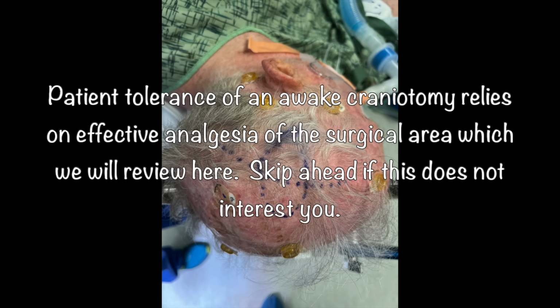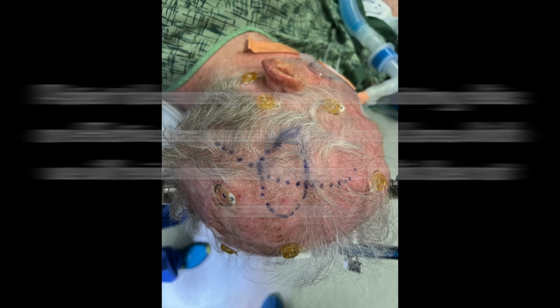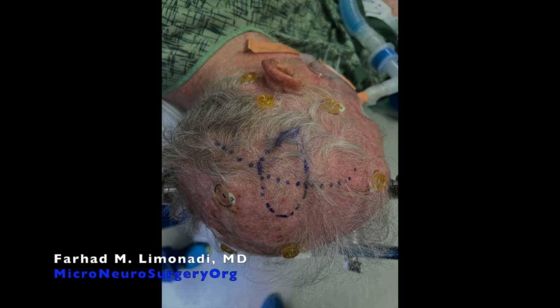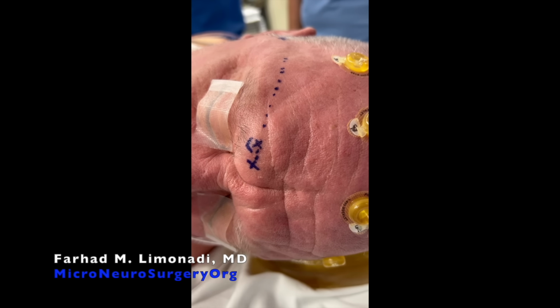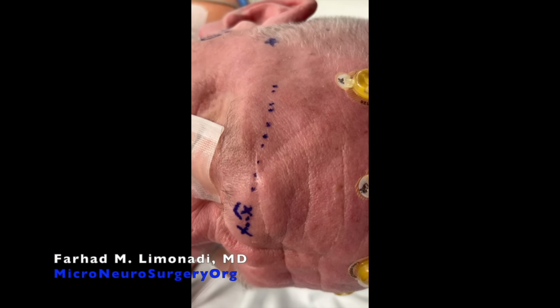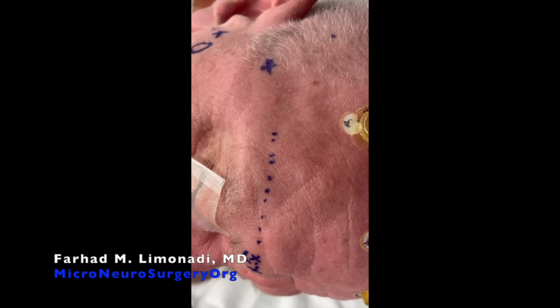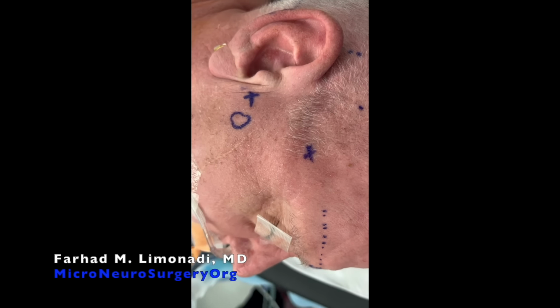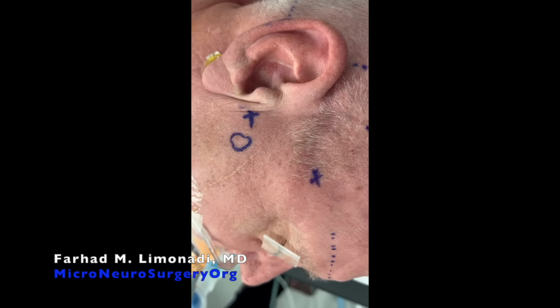Patient's tolerance of an awake craniotomy relies on effective analgesia of the surgical area, which we will review here. Skip ahead if this does not interest you. So after prepping his scalp with chlorhexidine, his scalp was blocked, essentially made numb, by infiltrating local anesthetic agent consisted of marcaine and lidocaine mixture along the course of 7 involved nerves.